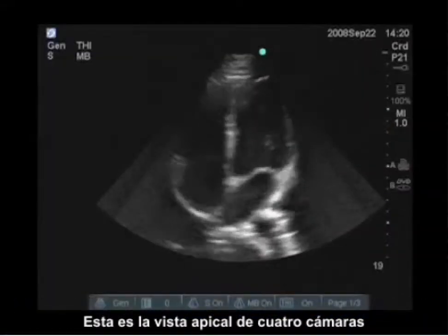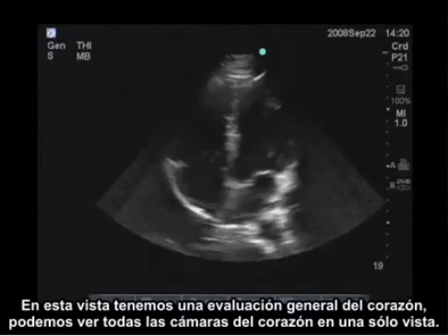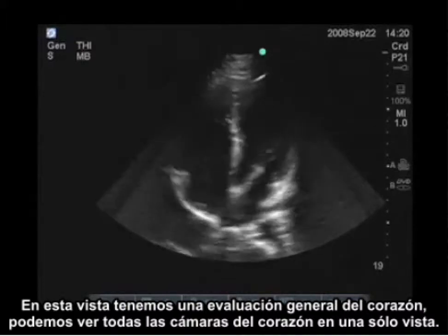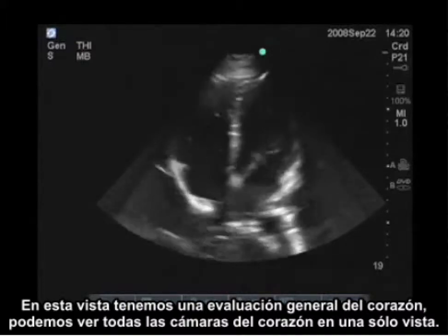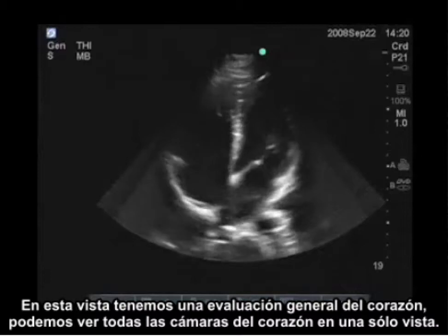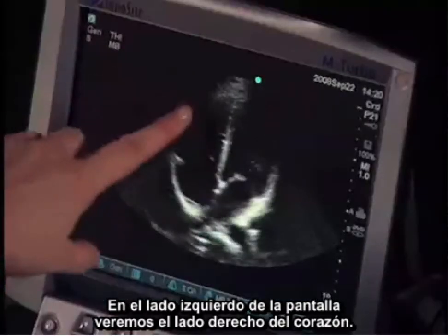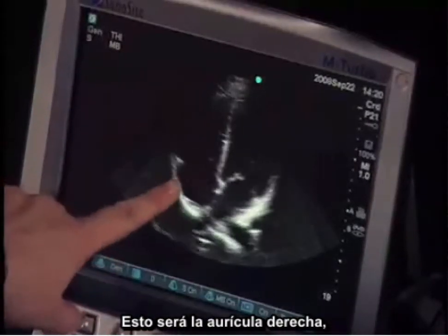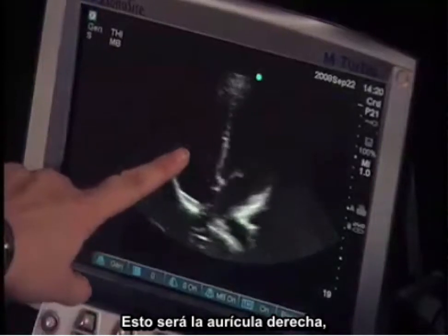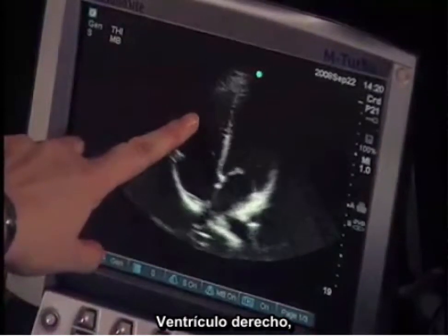This is the apical four chamber view. On this view, we have an overall assessment of the heart — we can see all chambers of the heart in one view. On the left side of the screen, we're going to see the right side of the heart, so this is going to be the right atrium, tricuspid valve, and right ventricle.